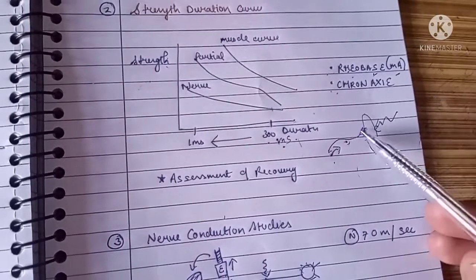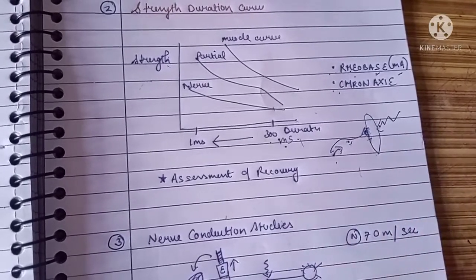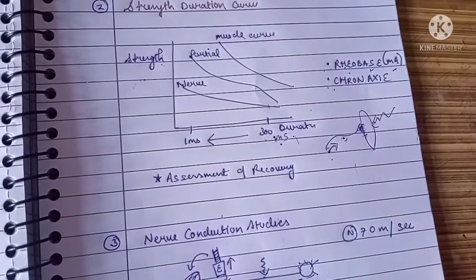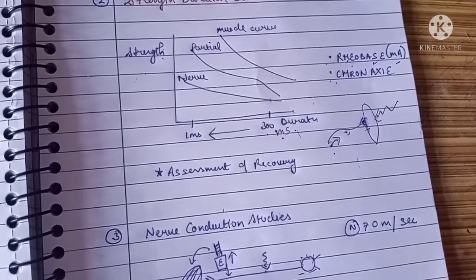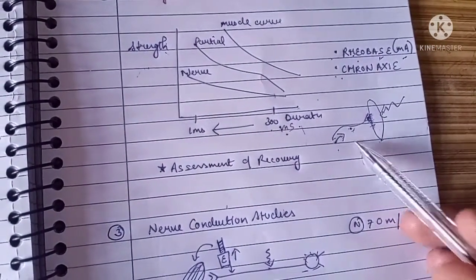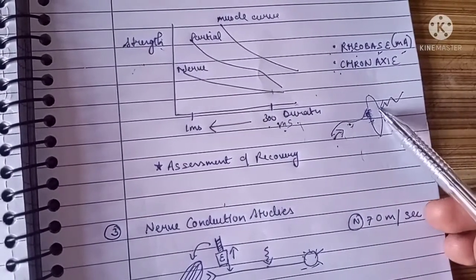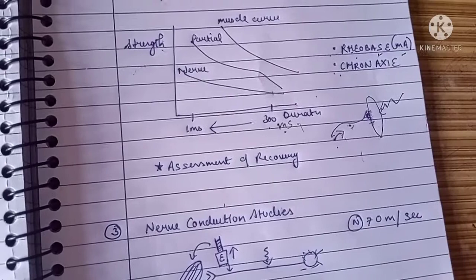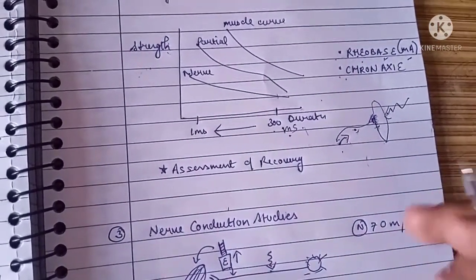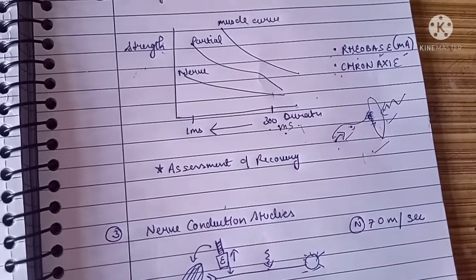The first thing is, when the muscle is stimulated directly via the nerve, the neurotransmitter is released and then the muscle is stimulated. During this process, a very low level of millivolts of potential is needed, as in the case of action potential normally. So we need to give a very low potential. In the case muscle needs to be stimulated directly for muscle contraction, a large amount of potential or millivolts will be required.